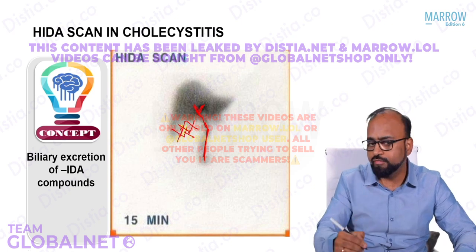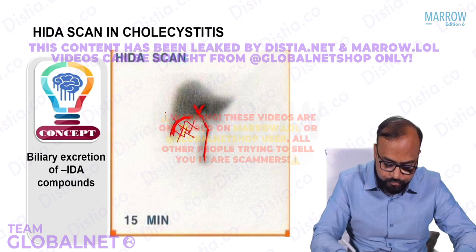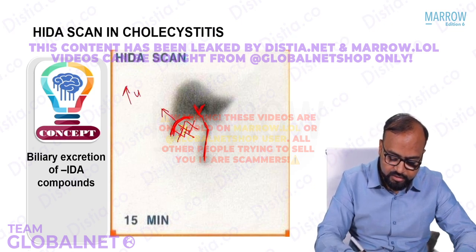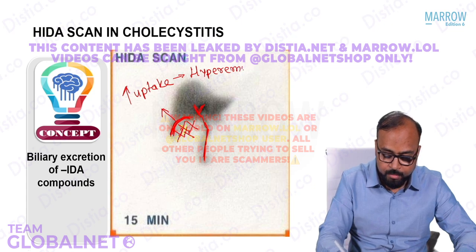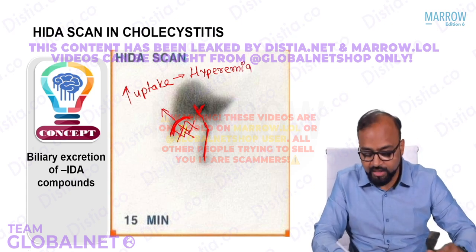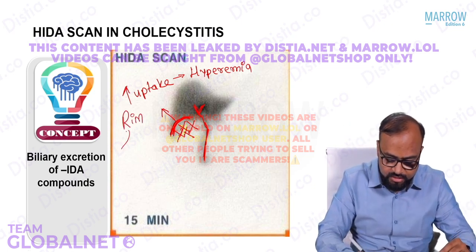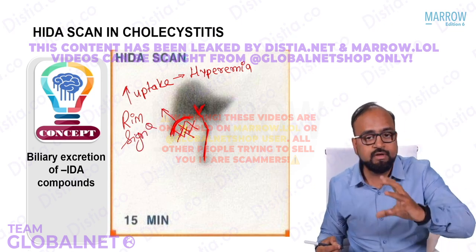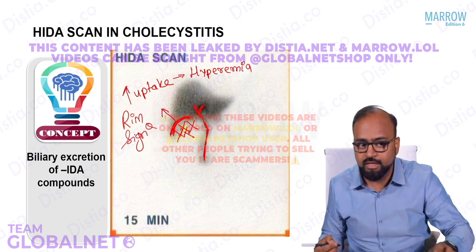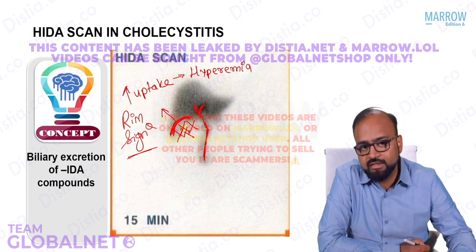Sometimes, occasionally, though it is not very well seen here, in this liver parenchyma here along the gallbladder, there may be an increased uptake of HIDA compound. That is because of the hyperemia here, because it is surrounding the inflamed portion. This liver parenchyma may have hyperemia. Increased uptake of HIDA compound is seen. This is given a name. This is called as the rim sign. Though it is not very well seen here, there can be an increased uptake along the liver parenchyma which lies along the GB fossa because of hyperemia. This is called rim sign. So this is about the concept of HIDA scan in cholecystitis.